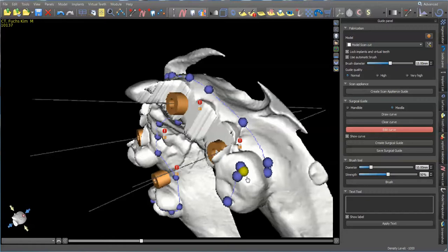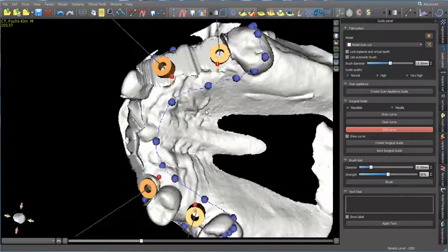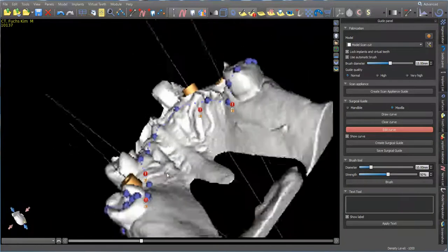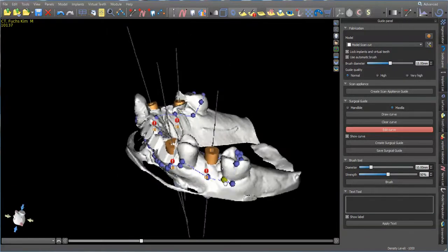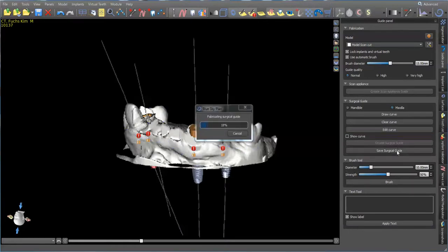So we're going to continue to modify it a little bit. I don't have to get this to seat all the way behind the tooth. And then moving this up a little bit. I don't need it to rest so much on the soft tissues. Looks good on that tooth. Alright, so I'm going to go ahead and finish this guide. Let's press create surgical guide.